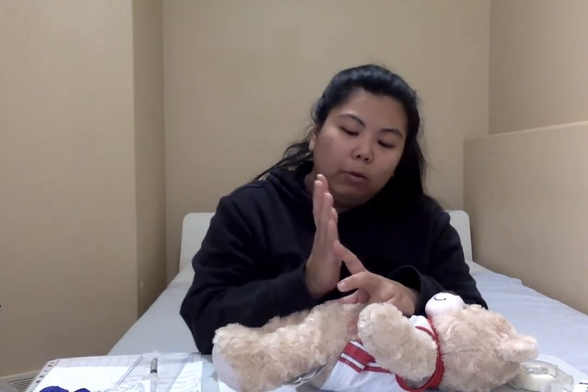And then we want to grasp the skin with our thumb and our ring finger, and then we can use our index finger and middle finger to stabilize the needle. And then we'll also rest the ulnar aspect of our hand on our patient's body. That way we can stabilize the needle.